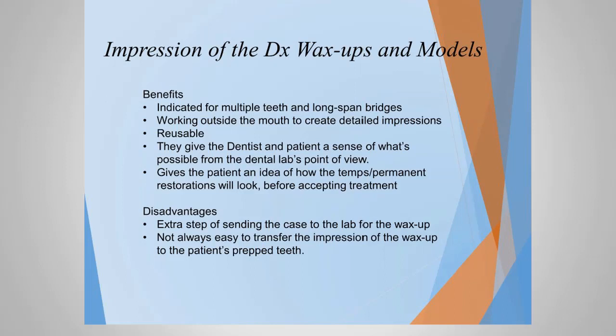The advantage of having diagnostic wax-ups is that they allow you to work with multiple teeth and long span bridges. They also allow you to work outside the mouth. Taking impressions is a lot easier on models as opposed to within a patient's mouth. Also, these diagnostic wax-ups and models are reusable, especially the models that are made based off the wax-up. These wax-ups give the dentist and the patient a sense of what the lab can do.